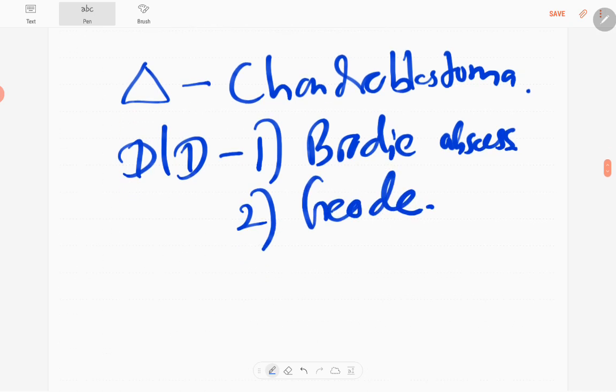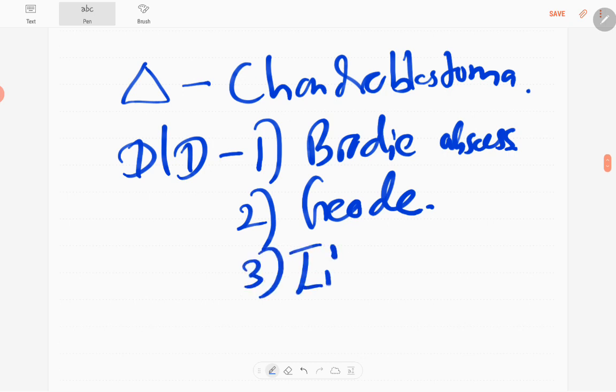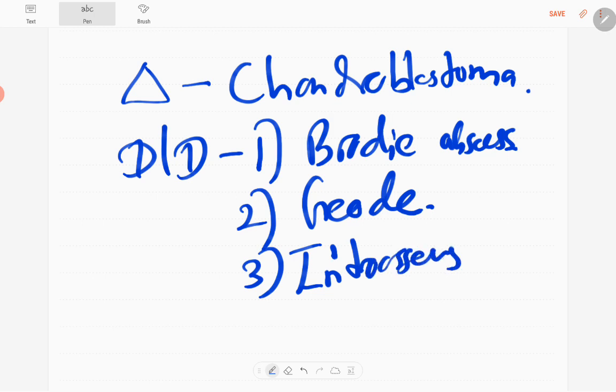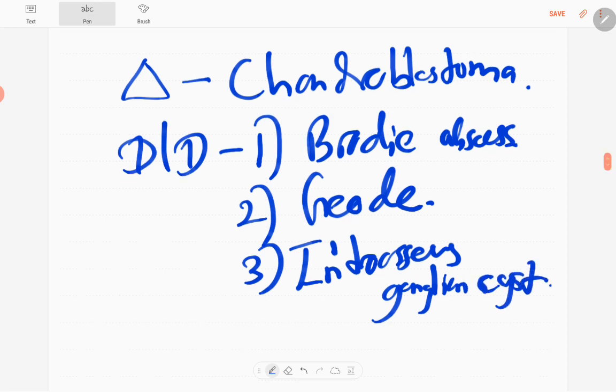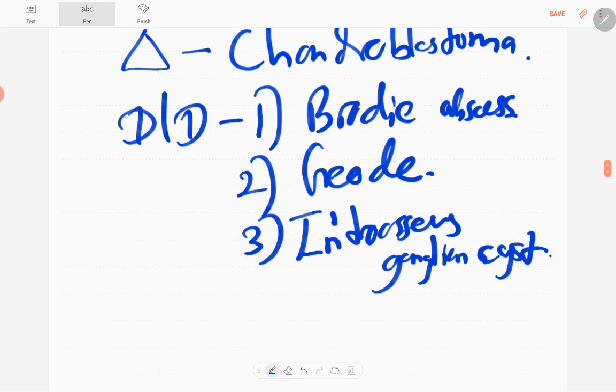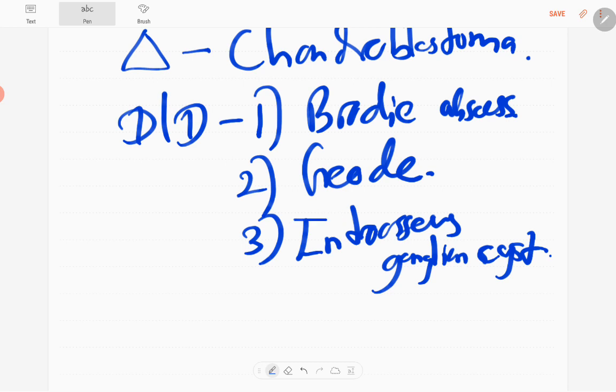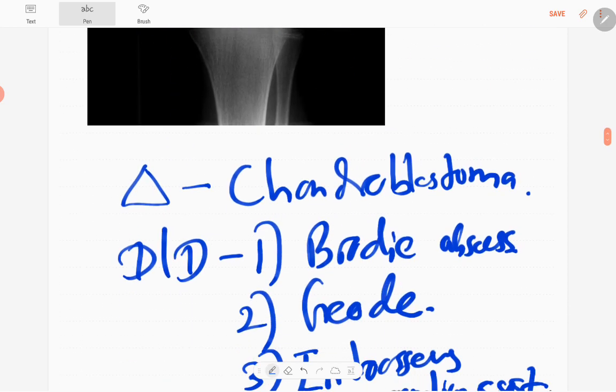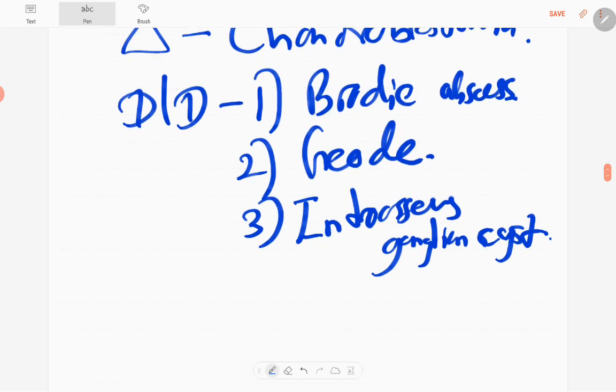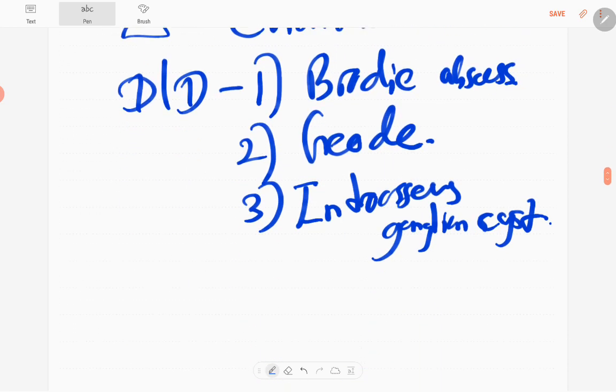Secondly, osteoarthritis with geode formation, and another one is intraosseous ganglion cysts. Those are the three main differential diagnoses of this lesion.